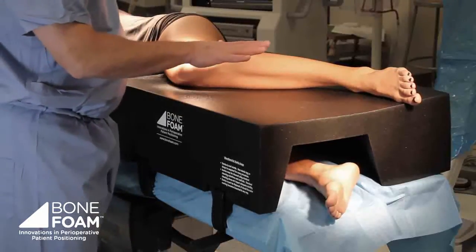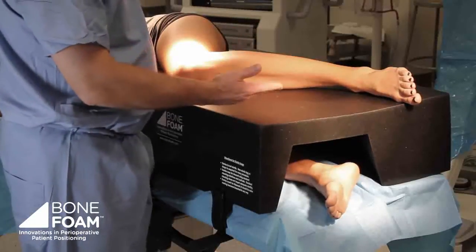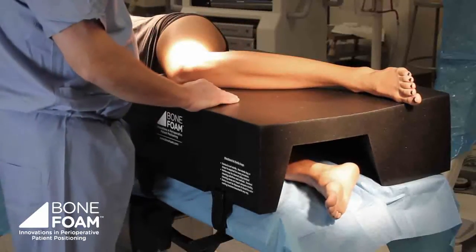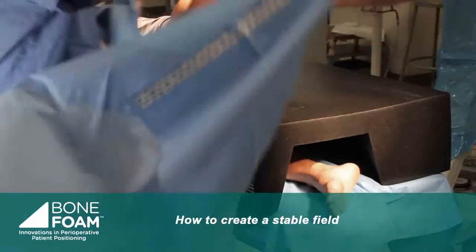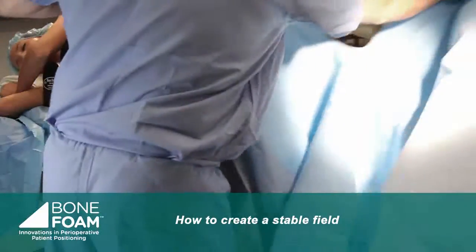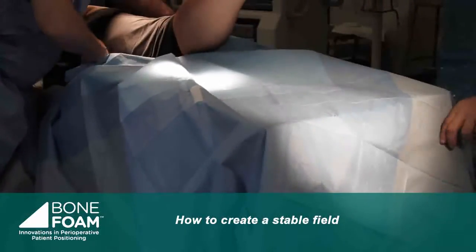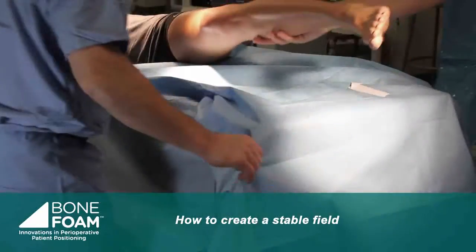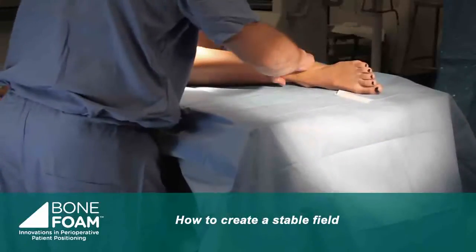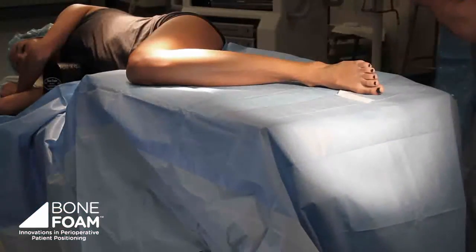The leg tunnel is not sterile. This piece actually goes under the drapes. Some of our pieces are designed to go above the drapes or below the drapes, but this piece is larger and it goes under the drapes. So what we do is cover the piece like so, and this becomes the surgeon's working surface. For the surgeon in this case, the calcaneus would be on this side of the table.